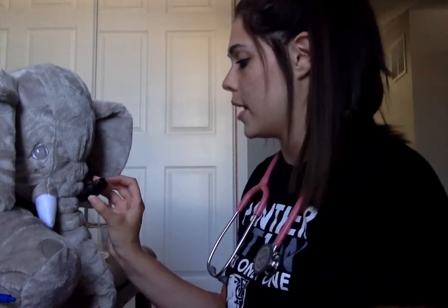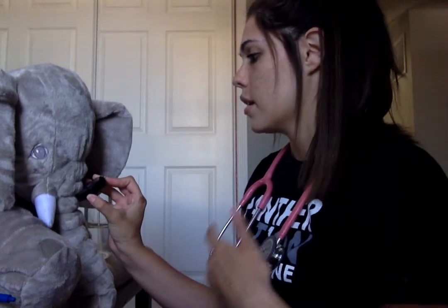So after you exhale away, you're going to seal your mouth around it, actuate it, inhale, then hold for 10 seconds, and exhale away. And then it's always a good idea to rinse your mouth out after using this. This medication can cause dizziness, tremors, and headache. Those are all common.